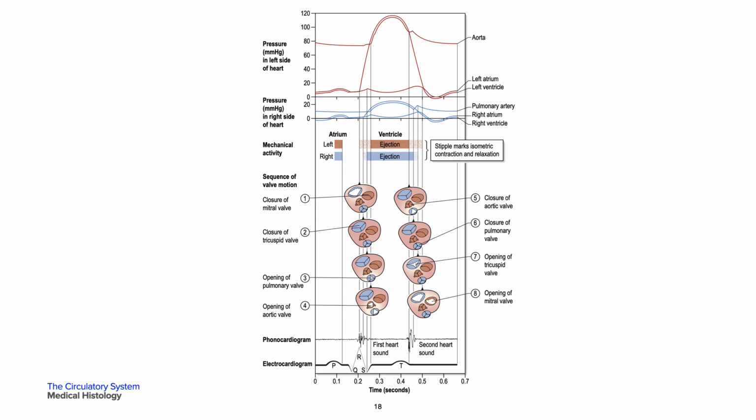The AV node is a compact bulb of smaller polyhedral myocytes merging with larger stellate to spindle myocytes with vacuolar sarcoplasm towards the bundle of His. There are mesothelial-like cells, and cystic structures are occasionally intermixed, along with the atrioventricular nodal artery, which courses through the AV node. Connective tissue surrounds the node, insulating the adjacent myocardium. The autonomic nerves and lymphatics are seen in the vicinity.